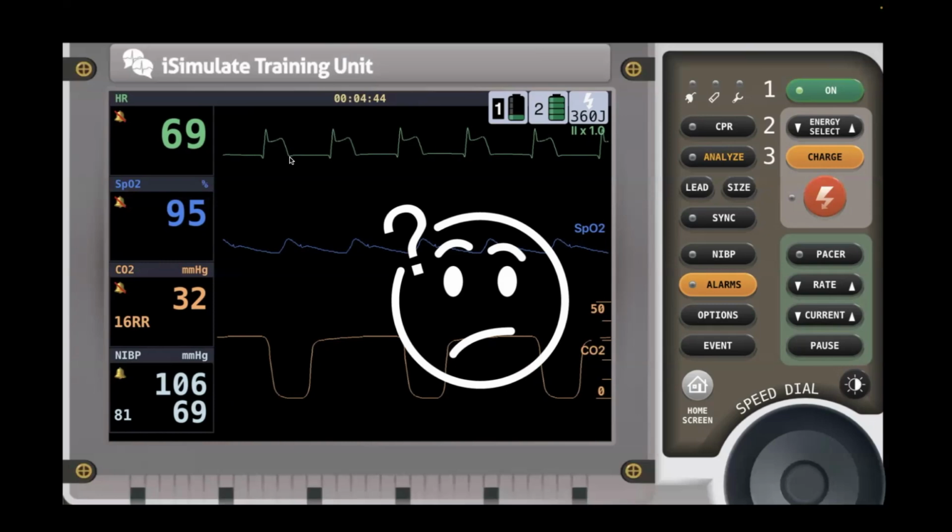Well, just like with your T wave, when you get repolarization, you get that change in potassium. So what happens when you get heart cell death, or as the tissue starts to become damaged, the T waves become tall and then they start to blend with the QRS. So one of the signs of a heart attack, if you have that STEMI, is that T wave blending with the QRS or hyperacute T waves, where they become high, greater than half the height of the QRS, because the cells are lysing or releasing the intracellular potassium. That's just kind of a cool gee whiz thing. At the end of the day, when you see a rhythm that you're like, that just doesn't look right, that's definitely one where you stop and say, hey, can you take a look at this?